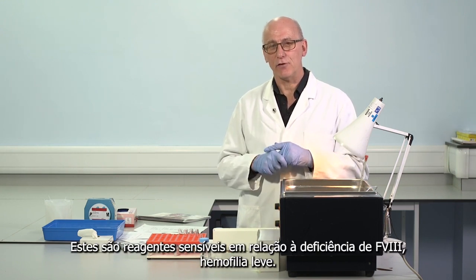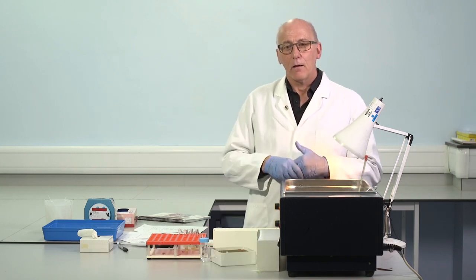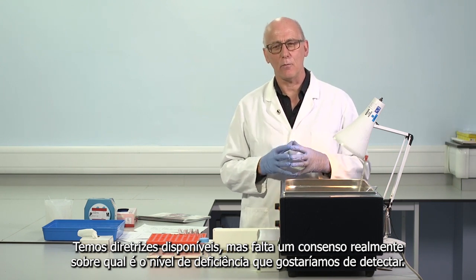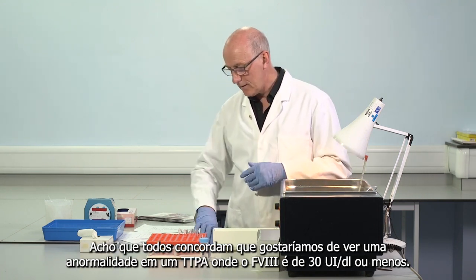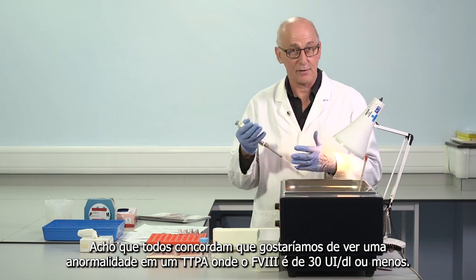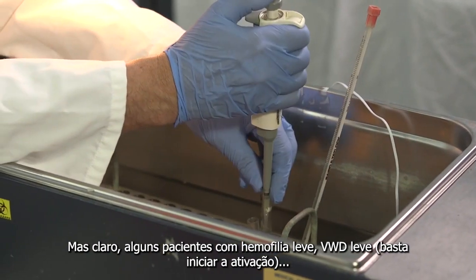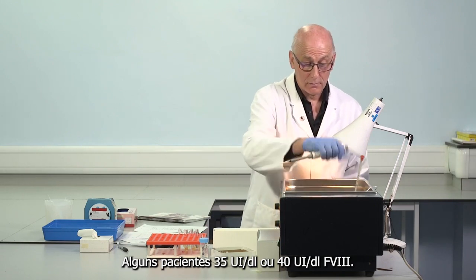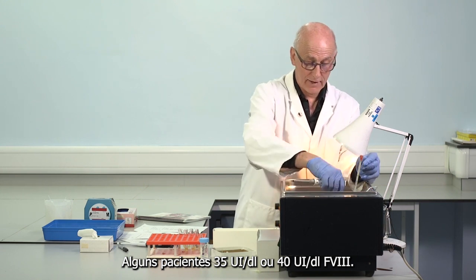These are sensitive reagents in relation to factor VIII deficiency, mild haemophilia. We have guidelines available to us, but there's a lack of consensus really on which level of deficiency we would like to detect. I think everybody has agreed that we want to see an abnormality in an APTT where factor VIII is 30 or less. That's a common feature. But of course, some patients with mild haemophilia, mild von Willebrand's disease, are just starting the activation. Some patients have 35, 40 units per deciliter factor VIII.